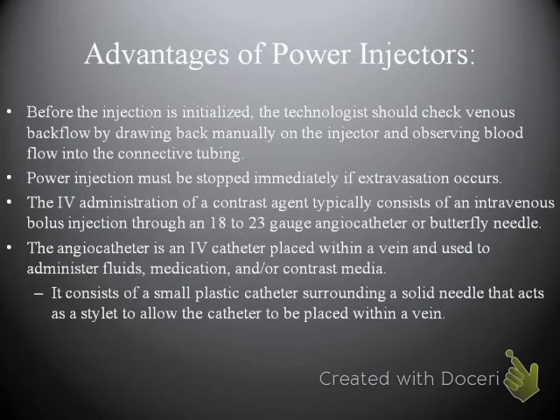So, in using a power injector, before the injection is begun, the technologist should check venous backflow by drawing back manually on the injector and observing blood flow into the connective tubing. I want to say that this is not always the case. Sometimes you cannot get blood flow to return back.